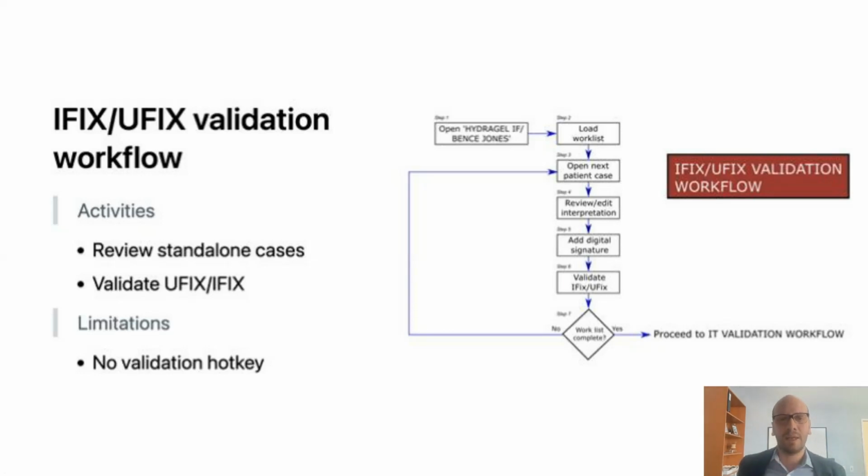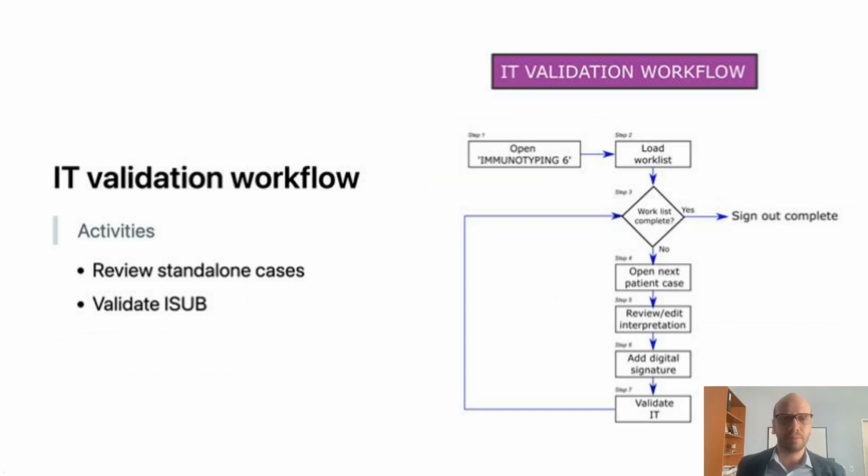One limitation here. In the other workflows, we were able to implement a validation hotkey, which is a nice productivity solution. So you don't have to click, you can just hit a single keystroke, and that's not available within this particular module of Phoresis. The IT validation workflow is similar to that for immunofixation. You can review the standalone cases and validate those immunosubtractions that have not already been validated in the SPEP process.